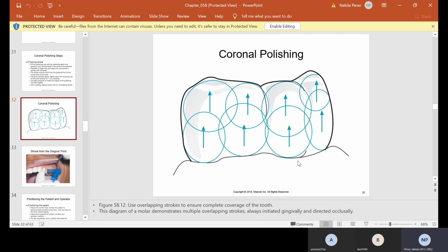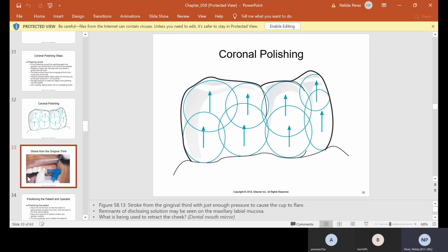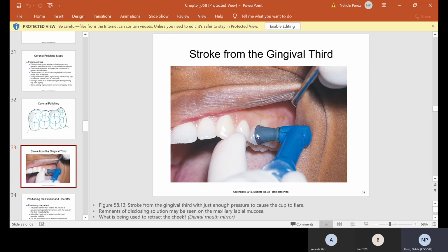now remember, you're stepping on the rheostat also, so it's revolving. You don't go in circles. It's already going in circles. You're going in one swipe, one, another one, and another one, and you keep on going. Now, here's the cup is flaring a little bit, so you do want it to flare a little bit. Notice how they're starting at the gum and then work their way down. In this case, this is a premolar. The premolar might only need 2 strokes.